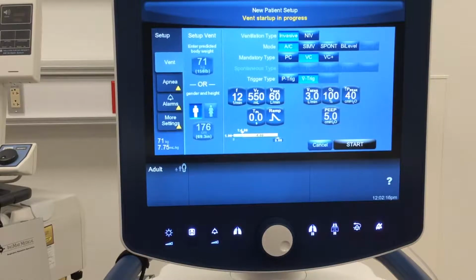Once we put a breathing tube in a patient, we're losing some of that normal FRC just for the fact that they're not actively breathing a lot of times. They have a tube in when they're exhaling. And them not actively participating in diaphragmatic contraction initially, we can have some atelectasis. So every one of our patients should typically be started out on a PEEP of 5. Are there some contraindications? Most notably, an untreated tension pneumo, you want to turn your PEEP down, so in an emergency room setting, that can be useful, but a majority of the time a PEEP of 5 is going to be totally fine. I call this maintaining a normal physiologic PEEP, okay?